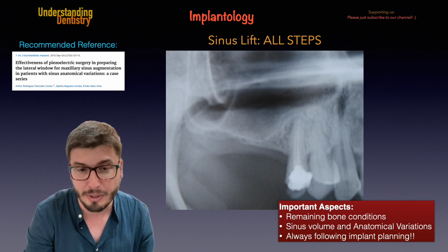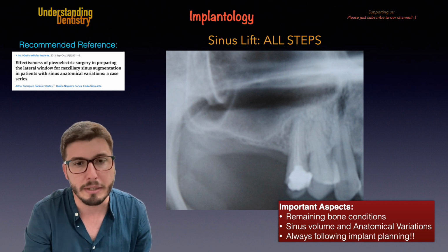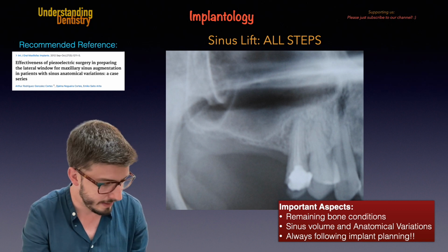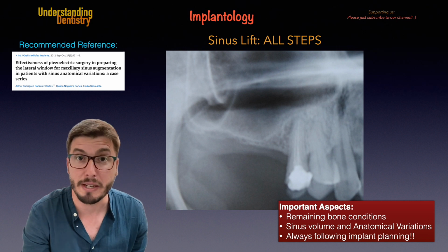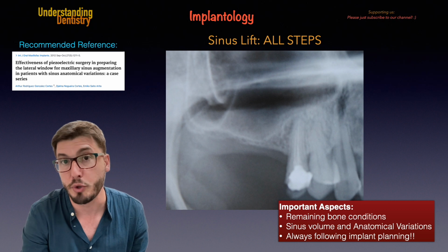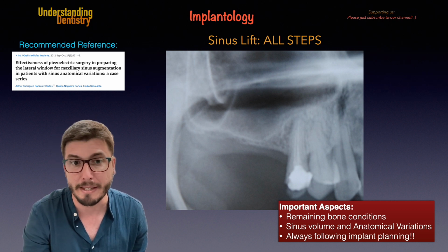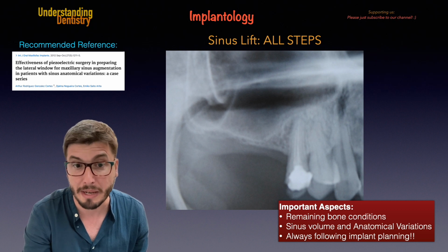So now take a look at this case. We are going to use this case to explain the steps. Regarding medical history, there were some important aspects to be discussed, but we are going to discuss this entire case in a future video. So let's focus on the sinus lift procedure and the implant planning procedure.